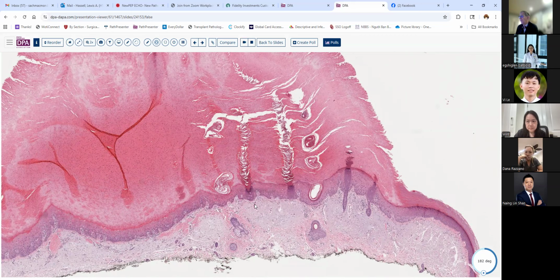So we know that it's also sun-exposed skin. So this could be from the arm, it might be from the face, back, probably not back of neck or back because the epidermis there tends to be thicker than it is here. So I would say, probably someplace on the forearm, hand, or face would be the most likely location for this.